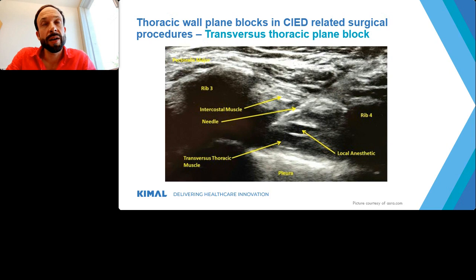And you know, when you do resuscitation, that's the point where you want to annoy the patient to have him wake up. So there are many nerves in this area, and therefore you want to have the patient covered as well as possible when conducting a CIED implant.